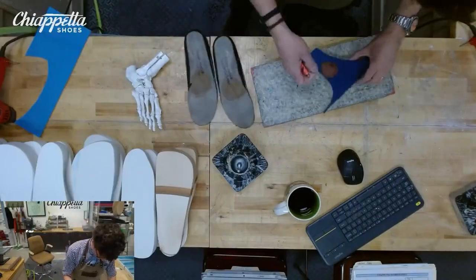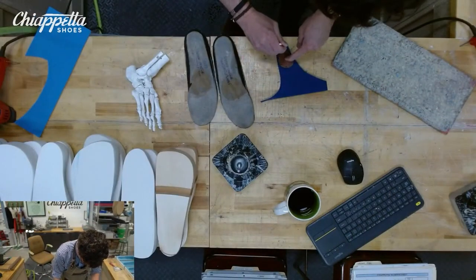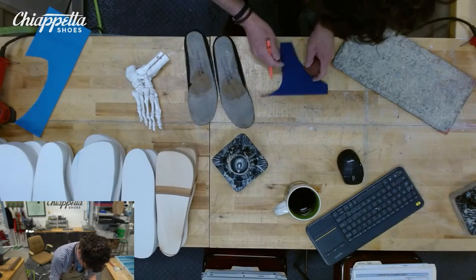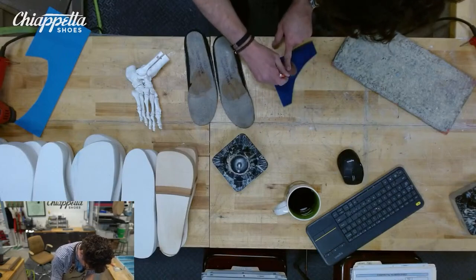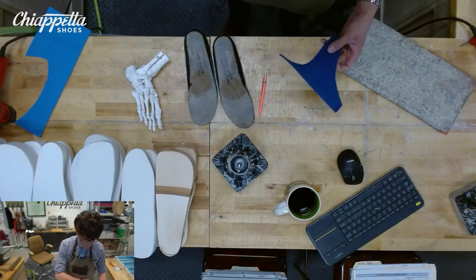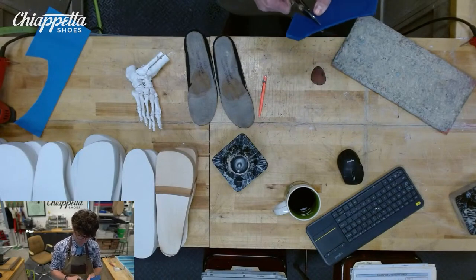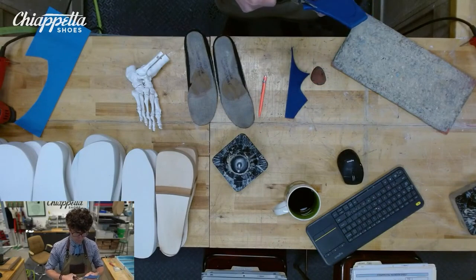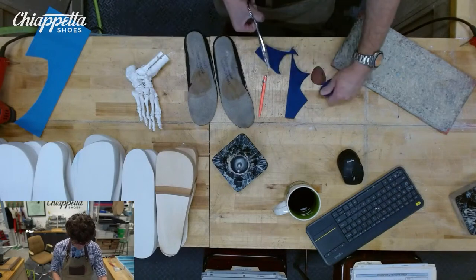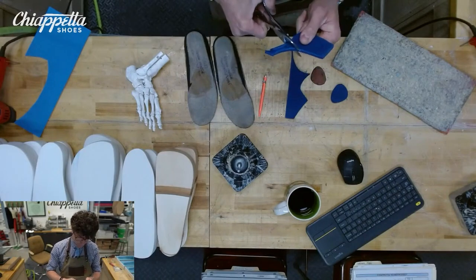What we're going to do here is we're going to shrink up this met pad. I want to get a little thicker and a little bit more focused. That gray piece that was on there before is about a 30 durometer EVA. That compresses over time, and this hammer toe's kind of popped up over the last year, so I don't know if that's been a factor of the old met pad kind of breaking down a little bit. She's very active. She says she likes doing yoga 3 to 4 full sessions a week, and she stretches, and she's very, very active. So, you know, in this situation, even if you're in great shape, weird stuff happens to the body and the feet. So that's what we're here for. We're the mechanics in the equation.